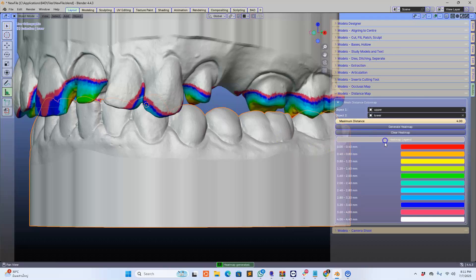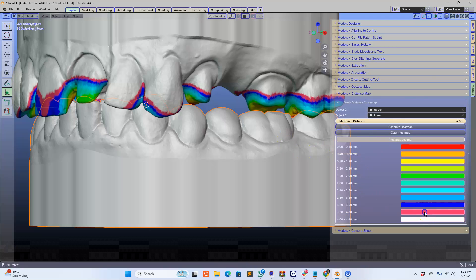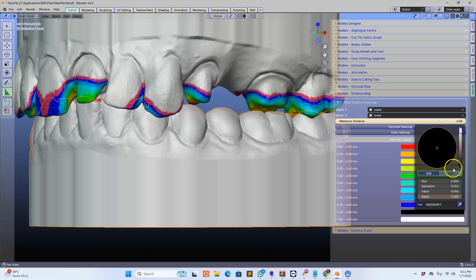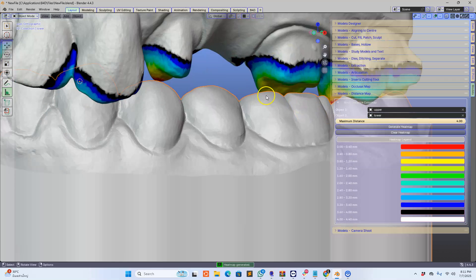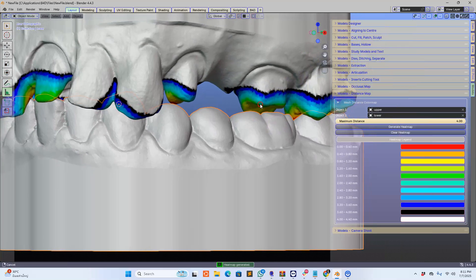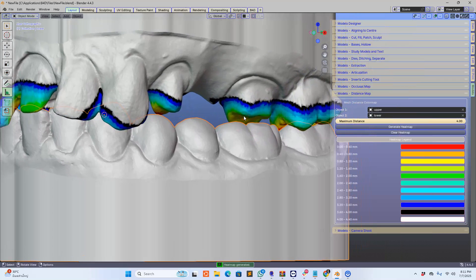Not only that, we can change the colors. So just say, for example, I want this in black and then generate heat map. We can then have it in black. Absolutely incredible.